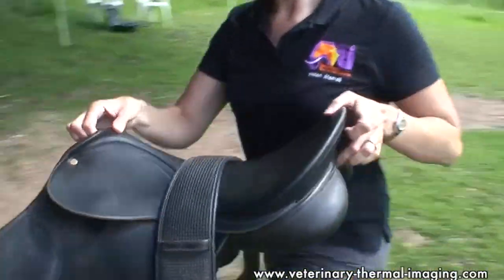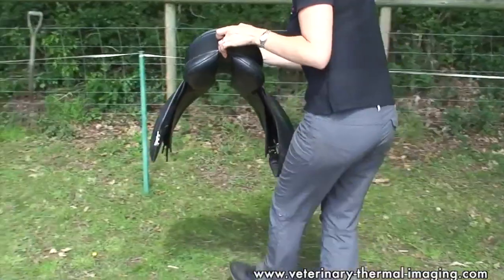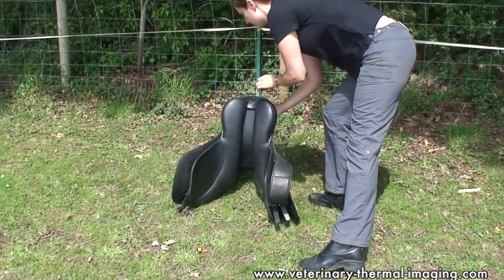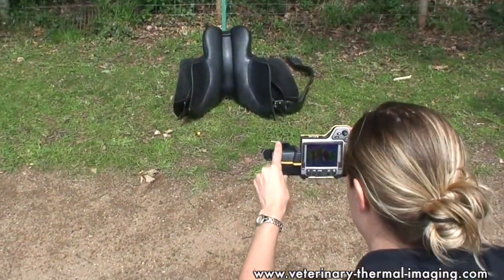First of all, the saddle is just placed on the horse's back for a few minutes, and then the image of the underside of the saddle shows which areas are in most contact with the horse's back. This will give you an indication of how well the saddle is fitting just while the horse is at rest.